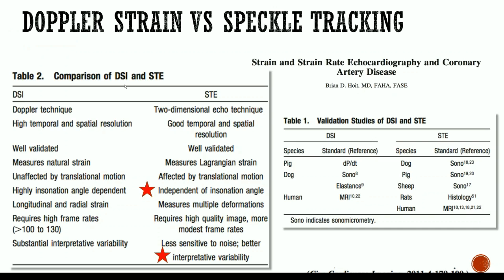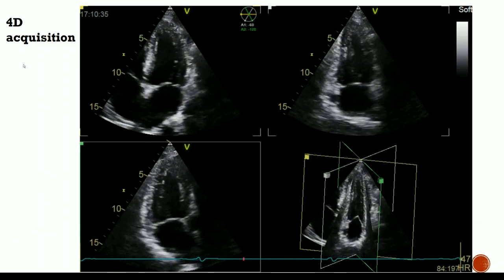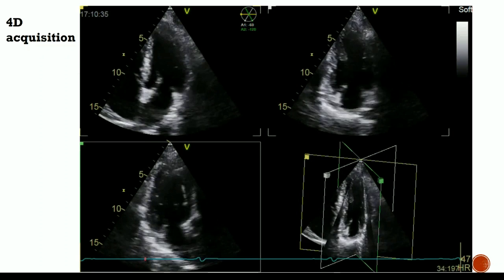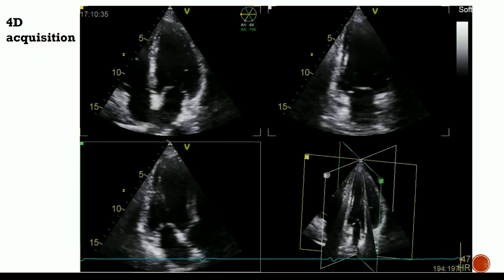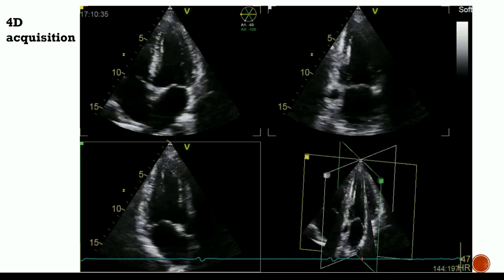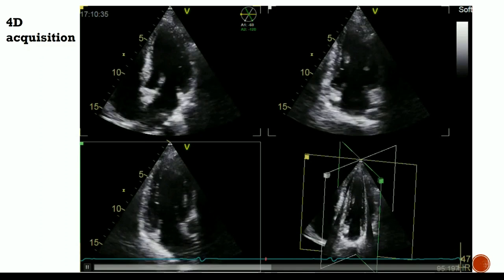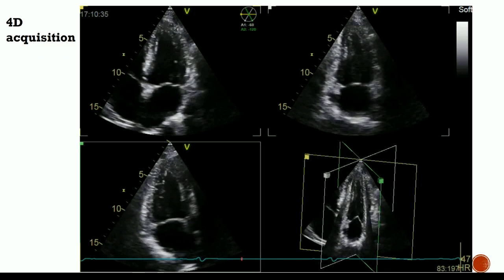So when you see a report about global longitudinal strain, and then you see some change in the global longitudinal strain and make some correlation to a finding, either in an individual patient's story or in some report, it sounds to me like you have to know the vendor and the type of acquisition, whether it's tissue Doppler or speckle tracking. And in the current technology, is speckle tracking considered the best or overall method? And then to go back to that, do all the major vendors use that technology?